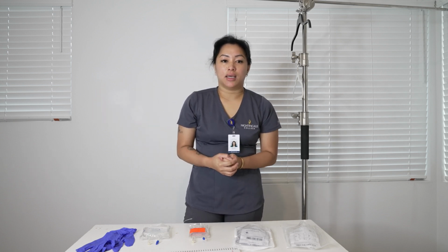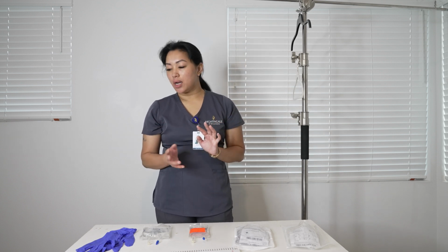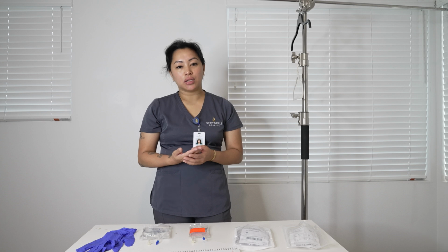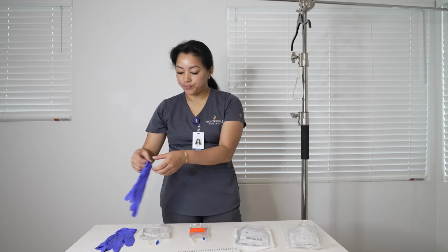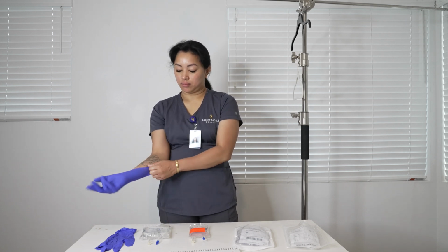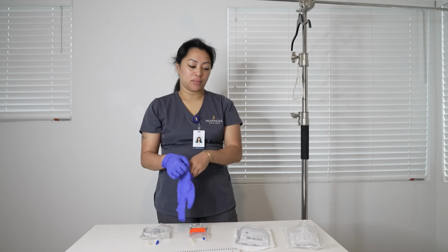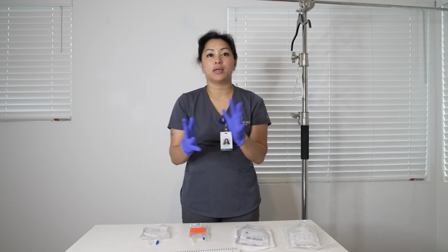And so I'm going to provide the privacy curtain, and then I'm going to wash my hands, and then everything's correct. I already asked for the allergies, no allergies. Wash my hands, and now I'm going to put on my gloves.